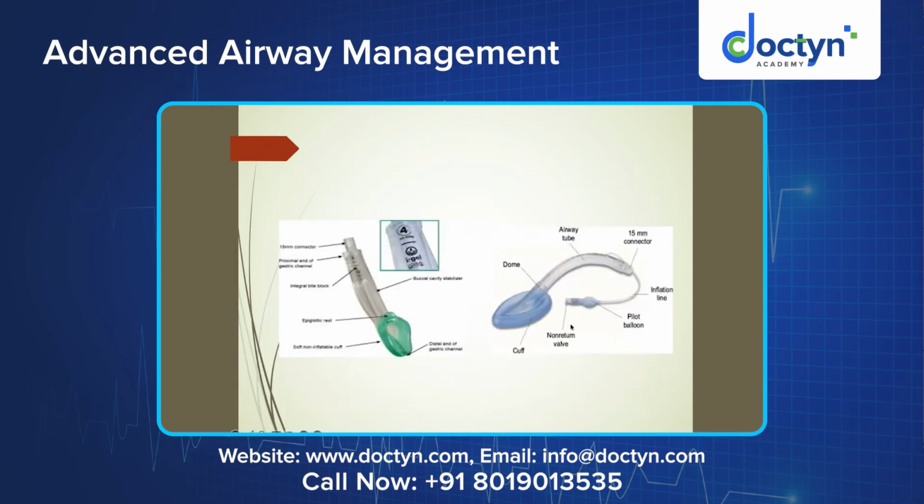You could see these are two different types of supraglottic airway device. The left one is called i-gel. The right one is a normal LMA. So you could see the right side LMA is laryngeal mask airway. As I said, the mask which is sitting directly on the larynx, and this forms an airway. This is an inflatable cuff, and this is a silicone gel, right? So this silicone gel forms the seal over the vocal cord once you have inserted it. Here, once you insert it, you have to inflate the cuff so that the adequate seal is established. So this one is all hard, which will not be collapsible tubing. And here this 15 mm connector gets connected to the ventilator tubing circuit as well, and also to the ambu bag. Same is here, the 15 mm connector connects to the ambu bag or a ventilator circuit.